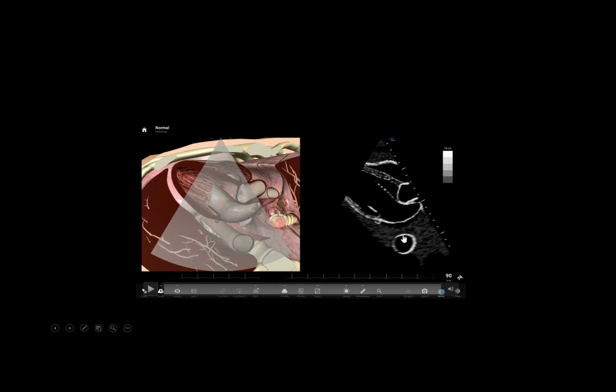You can also visualize any dilatation or aneurysmal descending thoracic aorta in this view, or any dissection flap can be looked for. And this is the E-point septal separation that Dr. Mathur was speaking earlier.